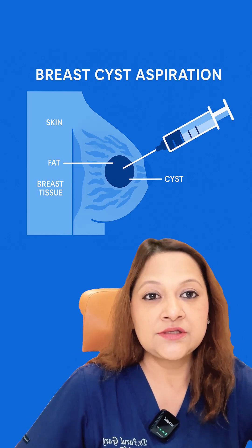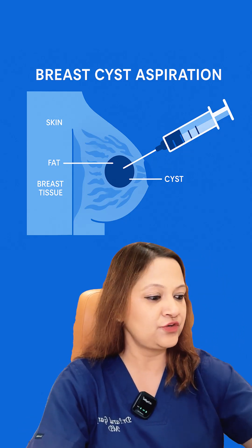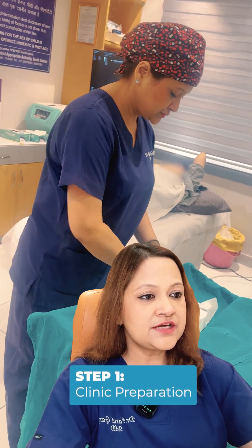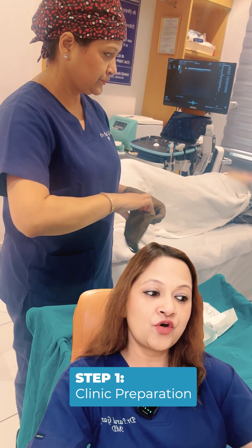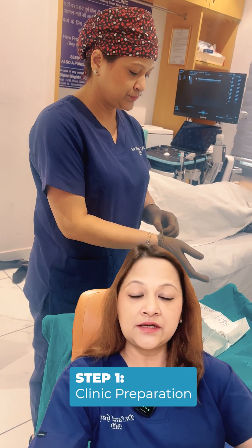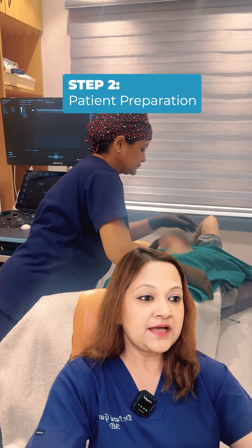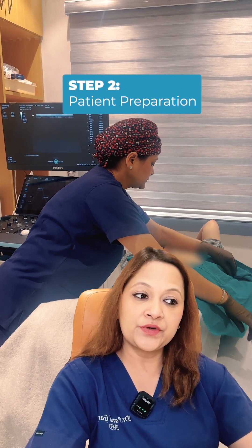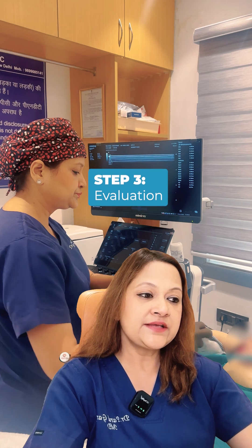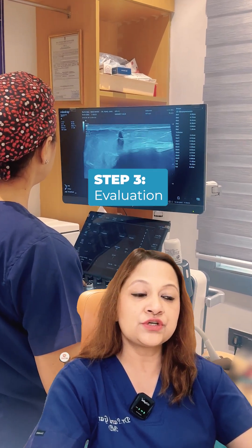I'll take you through this procedure of breast cyst aspiration. We are preparing for the breast cyst and it is done under sterile technique. After that, we put a sterile sheet over the patient.